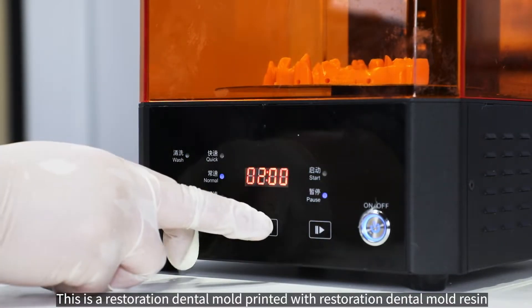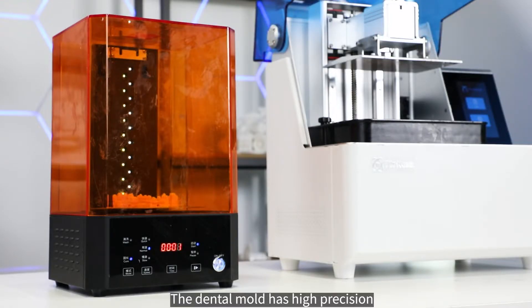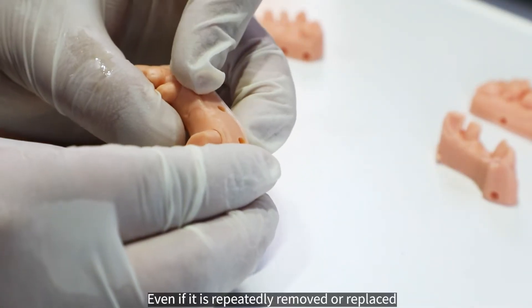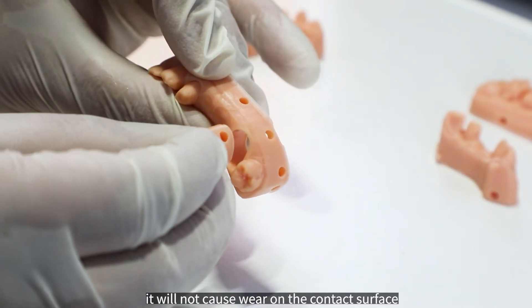This is a restoration dental mold printed with restoration dental mold resin. The dental mold has high precision and good scratch resistance after post-curing treatment. Even if it is repeatedly removed or replaced, it will not cause wear on the contact surface.